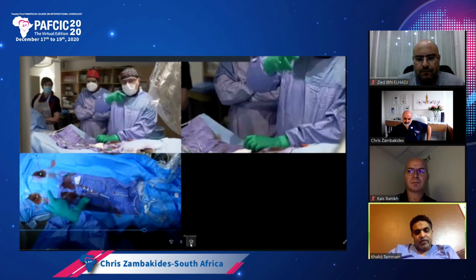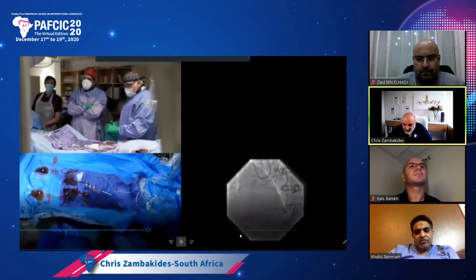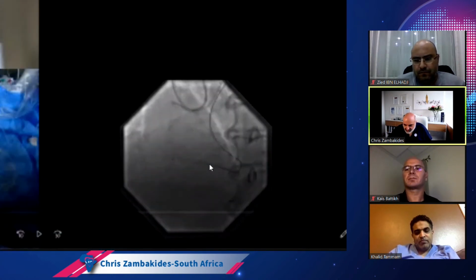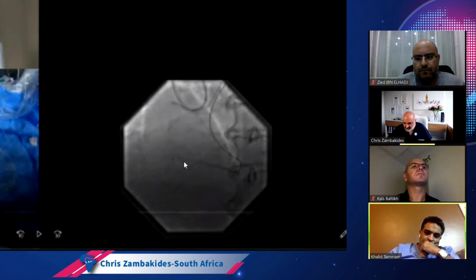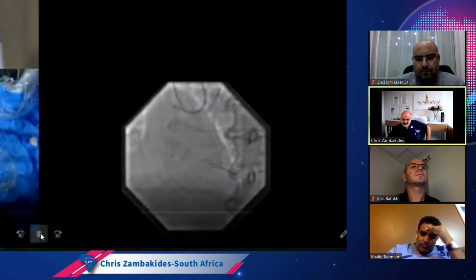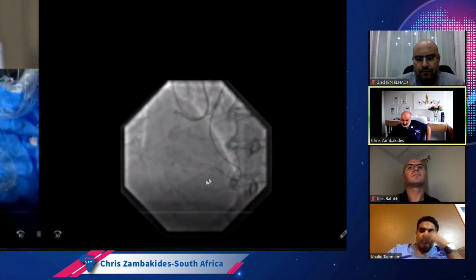I think you can run it until you see the video and then there we are. You explain for us. Yes, coming. Yeah. So the Gaia Second, I think I'm through this. So the crux is over here, and the stent starts over here. So there's about half a centimeter before the bifurcation. So it's a stent, half a centimeter, and then the bifurcation. So let me try and get the microcatheter. So we crossed with the Gaia Second, and it was in the right place.